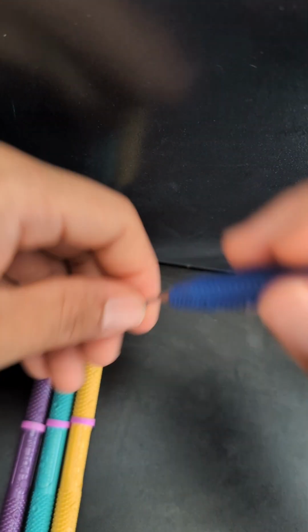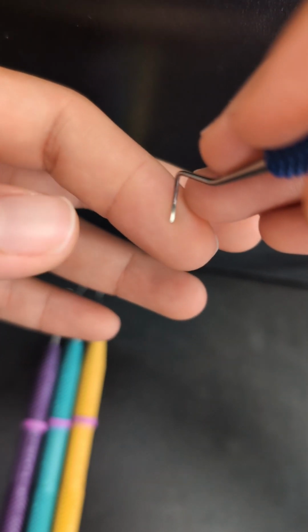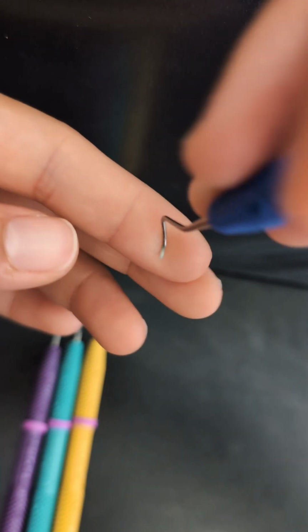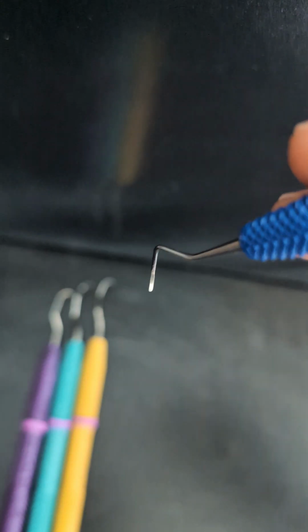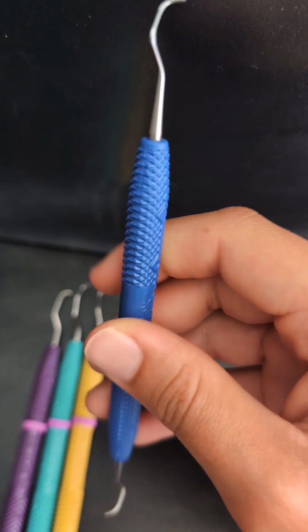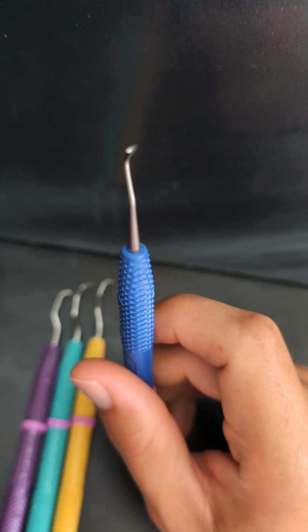If we take a look at the working end, we can see that the face of the blade is angled 90 degrees in relationship to the lower shank of the instrument. This instrument is double-ended and it has two cutting edges, one on each side of the blade. This instrument can be used for supragingival and subgingival calculus removal. It can be used on anterior teeth and posterior teeth, distal surfaces, mesial surfaces, buccal and lingual surfaces.